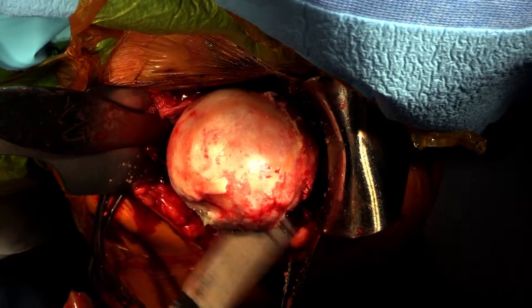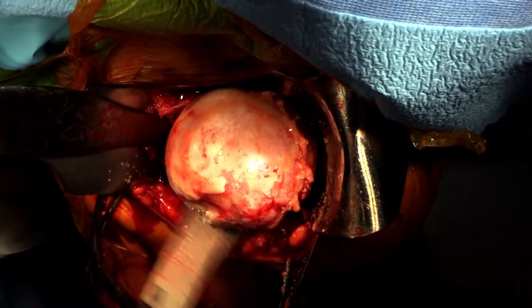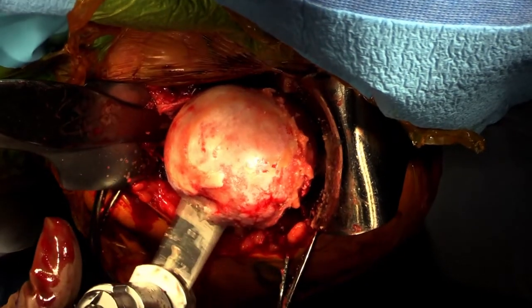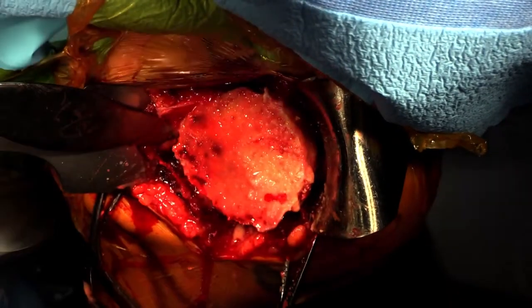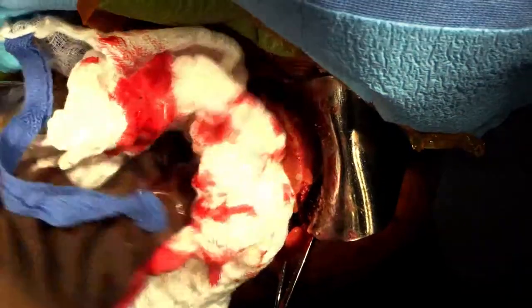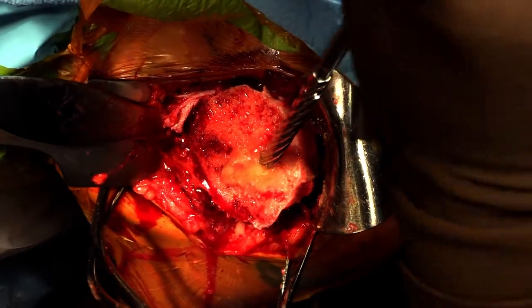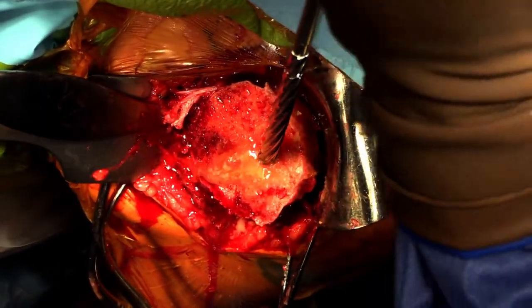In this case, the cut is made right underneath the osteophyte around the anatomic neck. Keep the head resection for bone grafting later. Notice that the patient has no biceps tendon. Ream sequentially until you feel light cortical chatter. The starting point should be about 1 centimeter posterior from the bicipital groove.